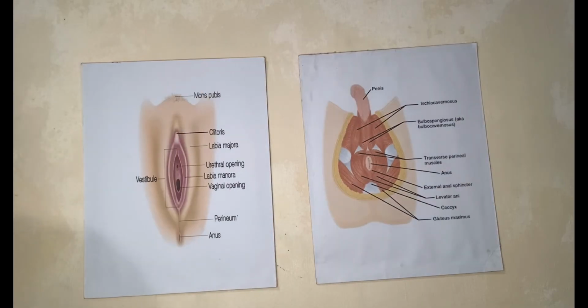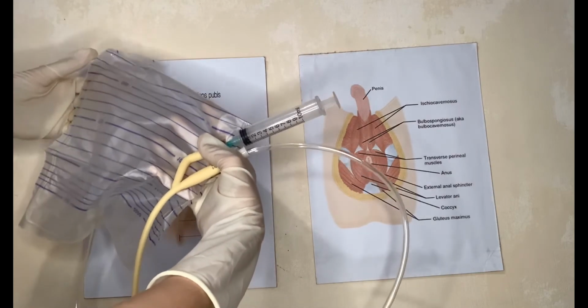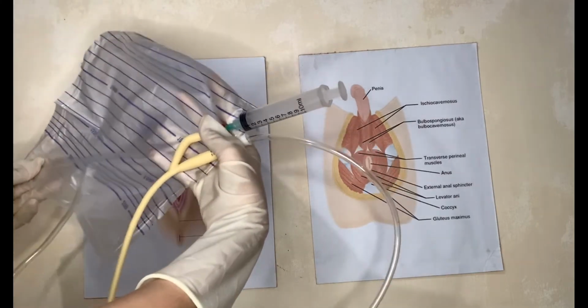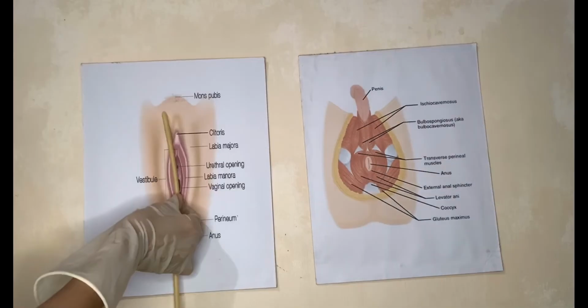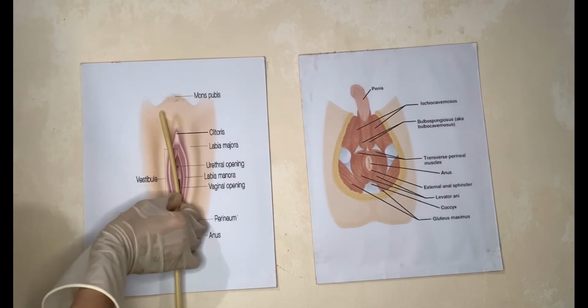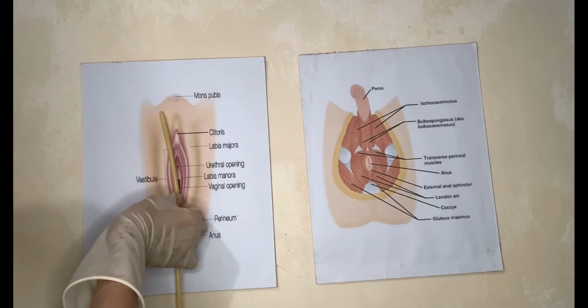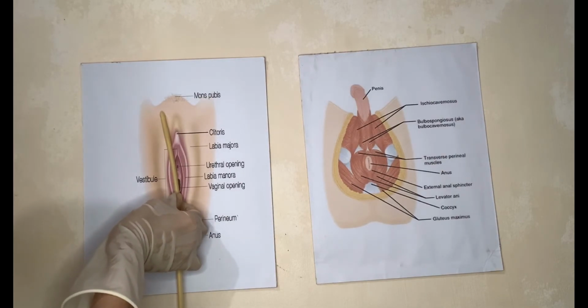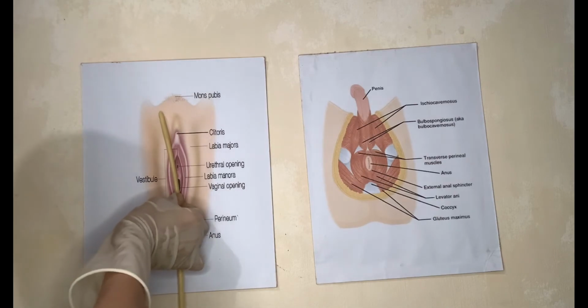We will now collect a urine specimen. For an indwelling catheter pre-attached to a drainage bag, a specimen may be taken from this bag this initial time only. So we can collect a specimen from the bag. Now we will allow the straight catheter to continue draining into the urine receptacle. If necessary, attach the drainage bag end of an indwelling catheter to the collecting tubing and bag.